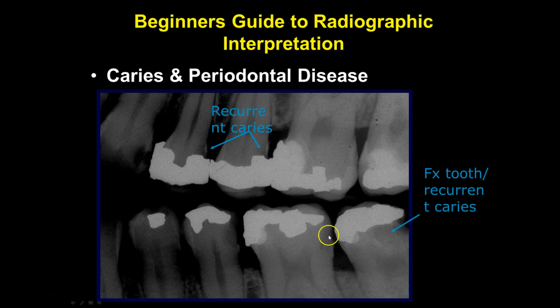Compared to a possible carious lesion here, we have some calculus, very irregular margins. We definitely have some radiolucent burnout here. Some significant caries, possibly a class 3 caries lesion, some overhanging margins, and recurrent caries. Why does that happen? Significant overhangs. When this restoration was placed, it created a very large seeping out of the amalgam material.